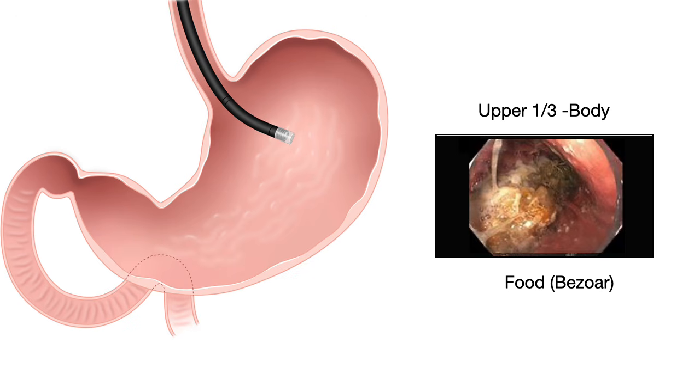So you want to pull out, ask your anesthesiologist to protect the airway if you need to do the procedure, and the protection of airway includes endotracheal intubation. So we've learned about different types of secretions that can collect in the stomach. It could be clear bile, dark bile, blood, or sometimes food.